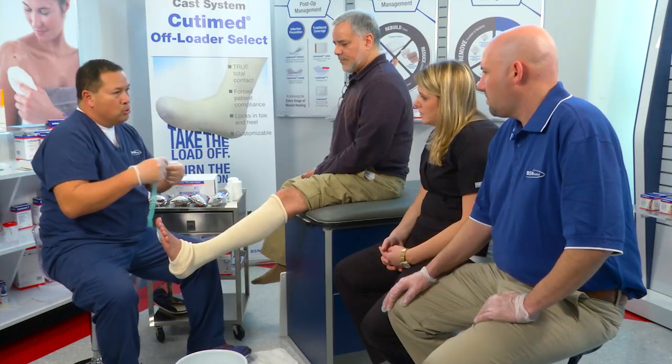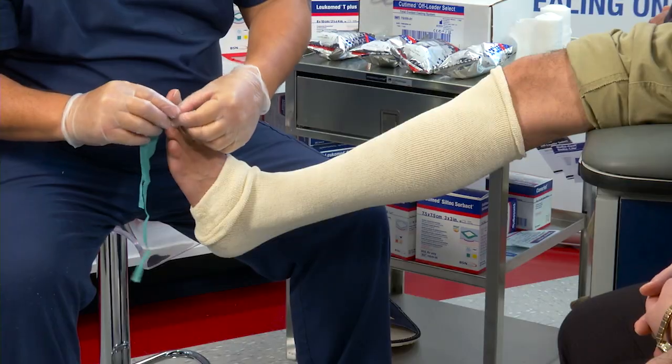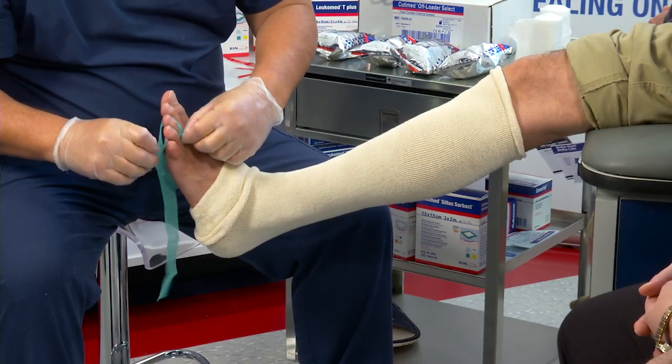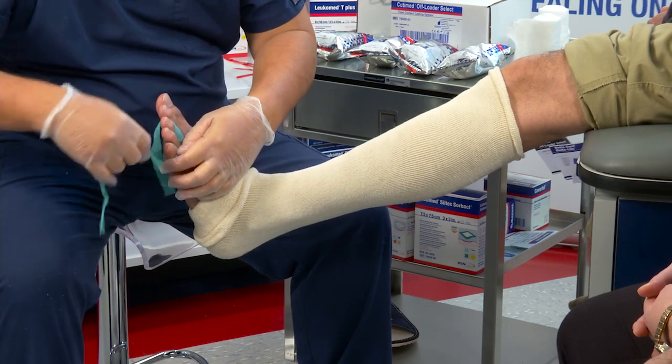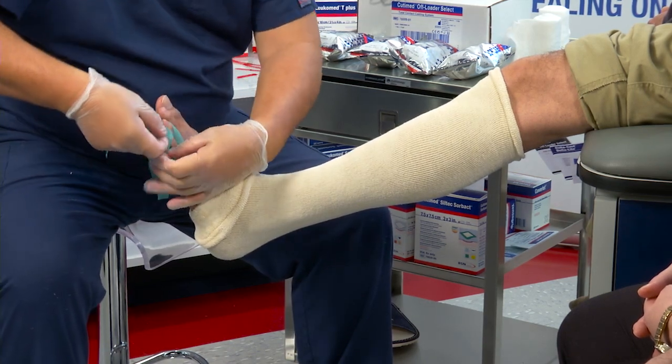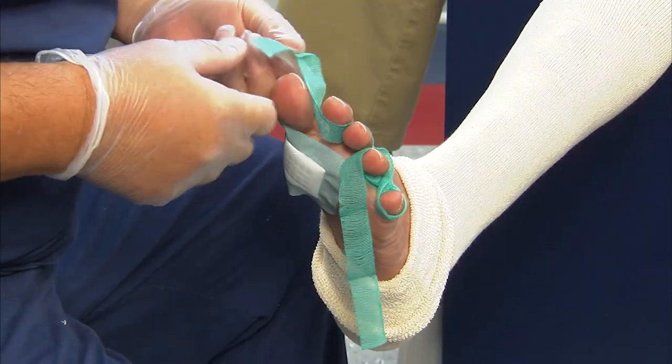Now I'm going to use some Soarback ribbon. Because he has tinea, what I like to do is just weave this in between his toes, between the digits. This will absorb some of the tinea and also keeps it from being skin-on-skin contact to reduce that risk of maceration.